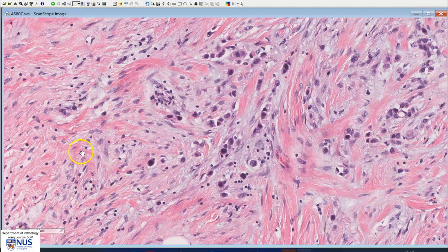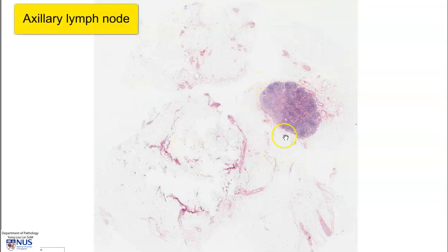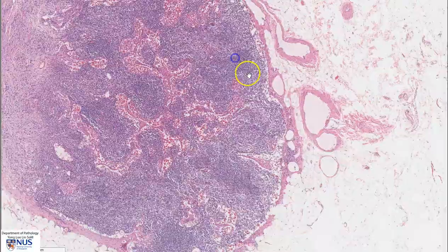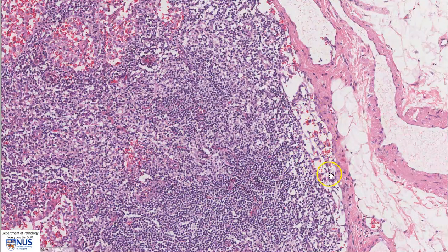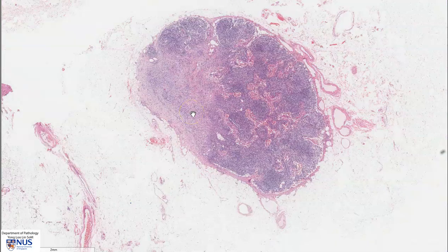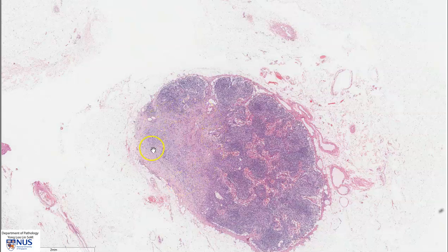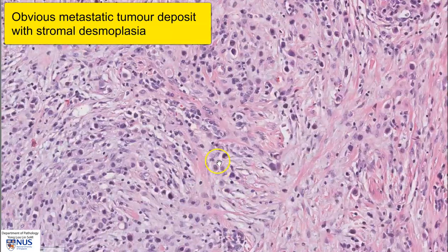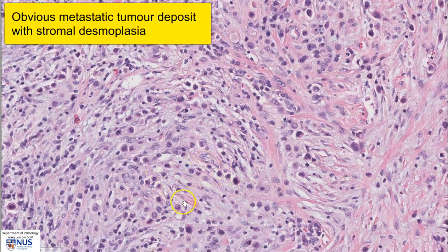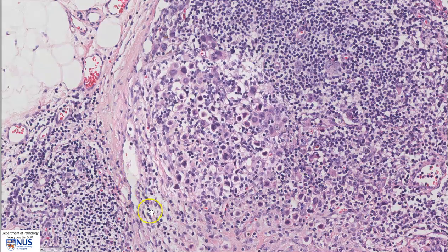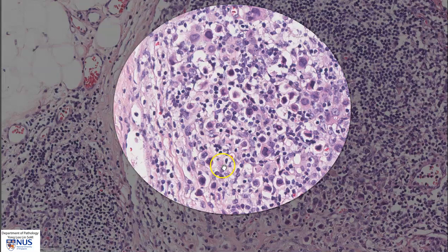This particular case also had nodal metastases. Here is an example of an axillary lymph node from this patient. We can see the normal lymph node with the capsule and the subcapsular sinuses. Sometimes metastatic lobular carcinoma can be very subtle, especially on frozen section examination of sentinel lymph nodes. However, in this particular case, there is an obvious tumor deposit with associated stromal desmoplasia. We can see these malignant epithelial cells infiltrating into the stroma, with a marked desmoplastic stromal response with spindled myofibroblasts and some inflammatory cells. We can recognize these metastatic carcinoma cells because they are larger than the lymphocytes.